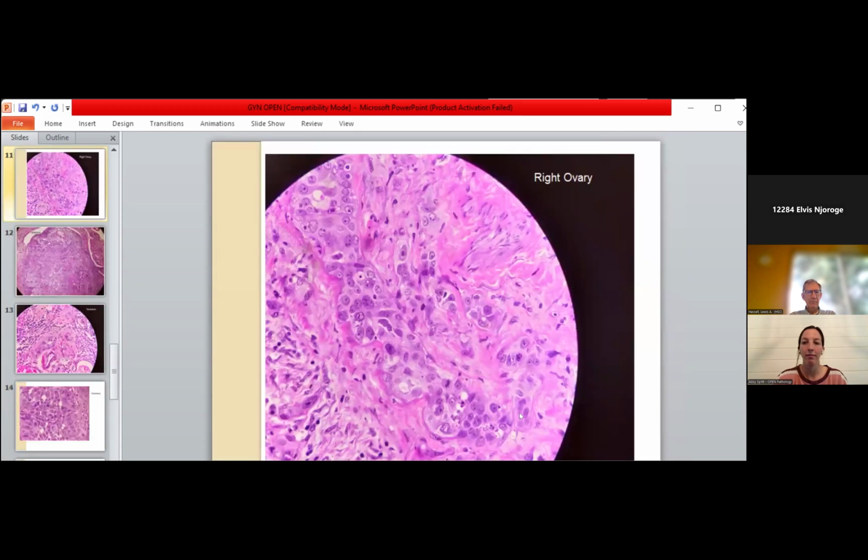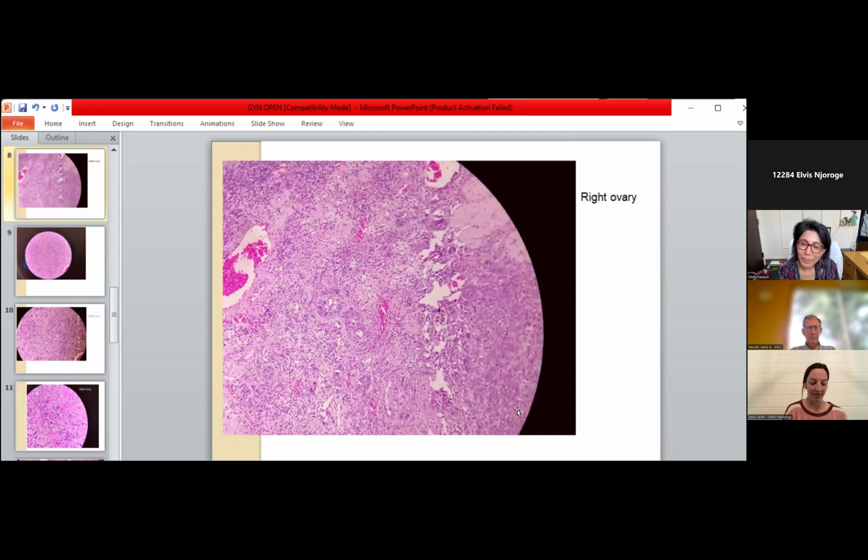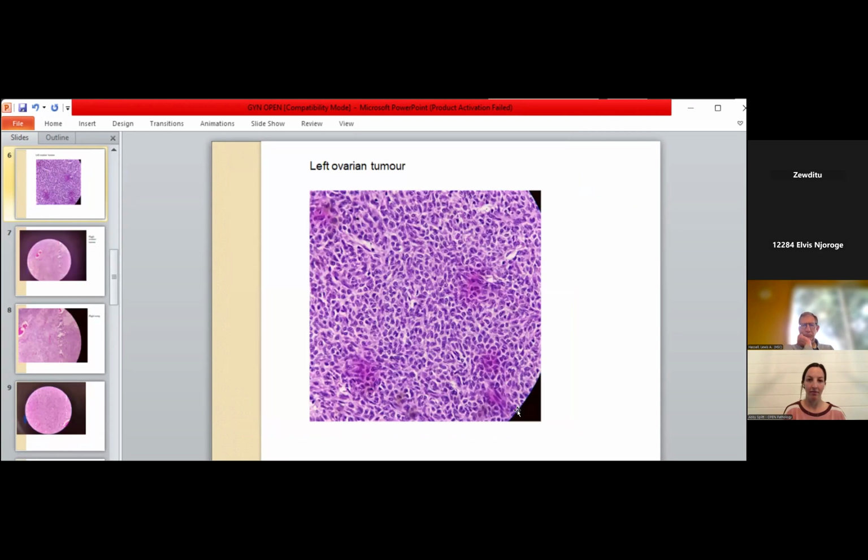Okay, thank you for a beautiful case, and your pictures are gorgeous, by the way. Does anybody else want to comment on the case first? Just whatever your thoughts are. Zudi too, maybe? I have actually something similar to an adult granulosa cell tumor for one of the ovaries, and adenocarcinoma, probably metastatic, for the second ovary and the omentum, of course. Okay. Anyone else?